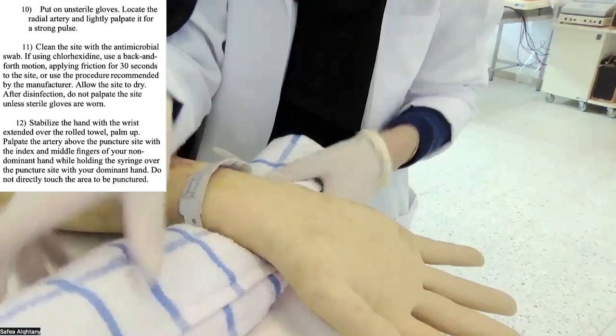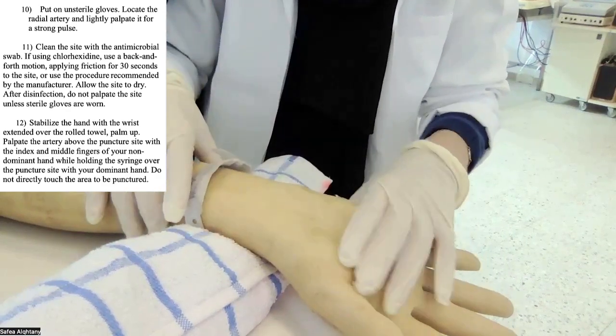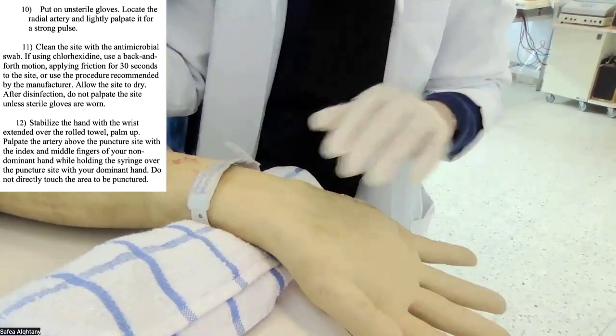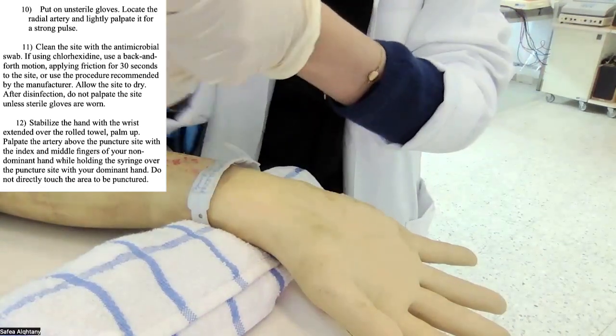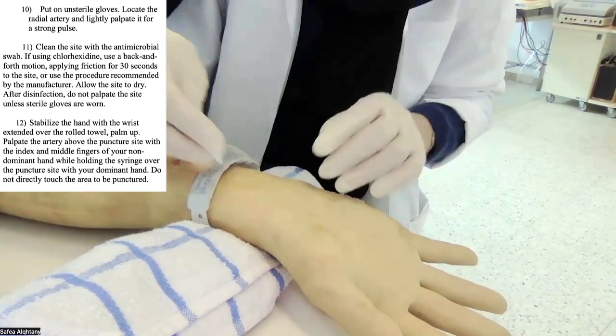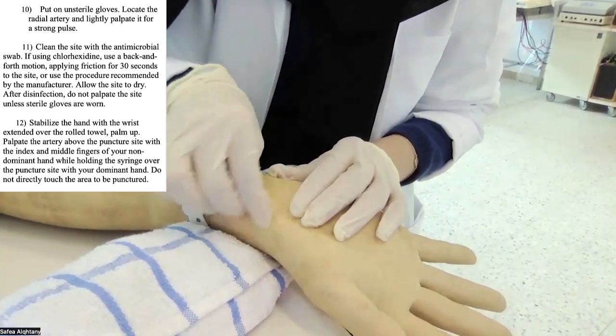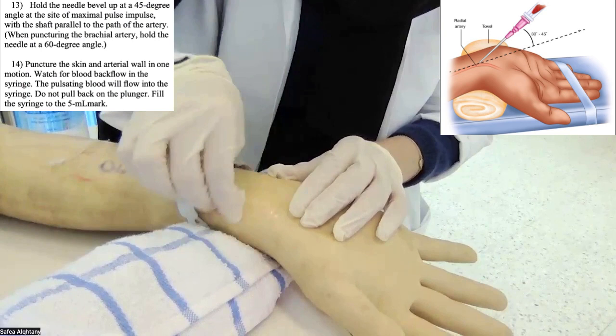So I can use the rolled towel in order to stabilize the hand, the palms up, okay, and the wrist extended. Now I need to clean the site with alcohol swab for 30 seconds using friction movement.